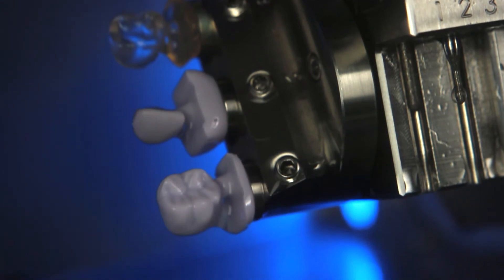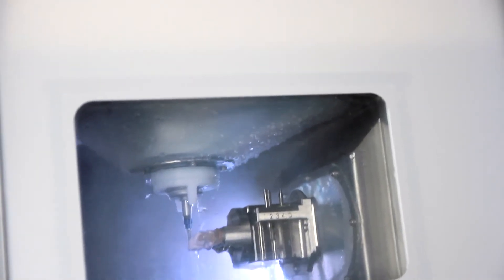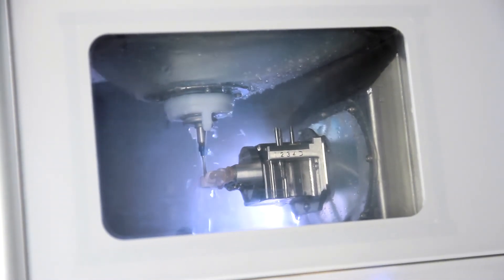The DWX4W combines unbeatable performance with legendary Roland DG reliability to make easy work of the latest wet milling materials.